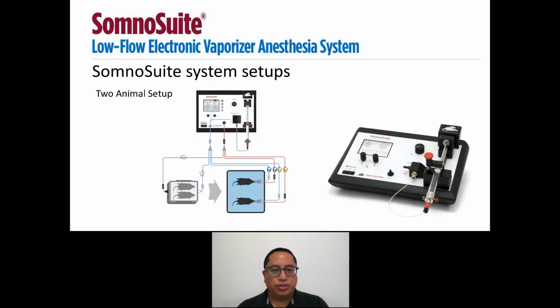This diagram shows how a 3 accessory adapter can be used to connect to the Somno suite. In this case, we have 1 induction chamber and 2 face masks. So now you have an additional station to work from.